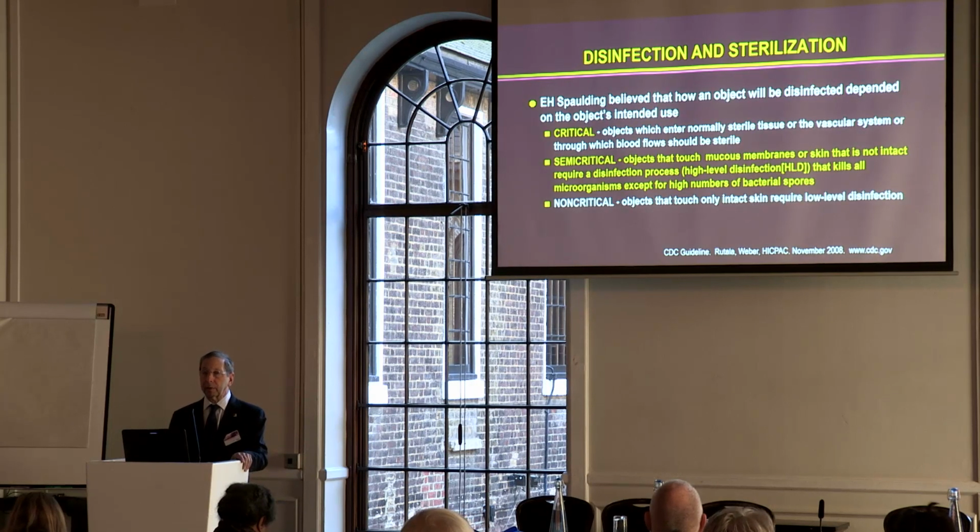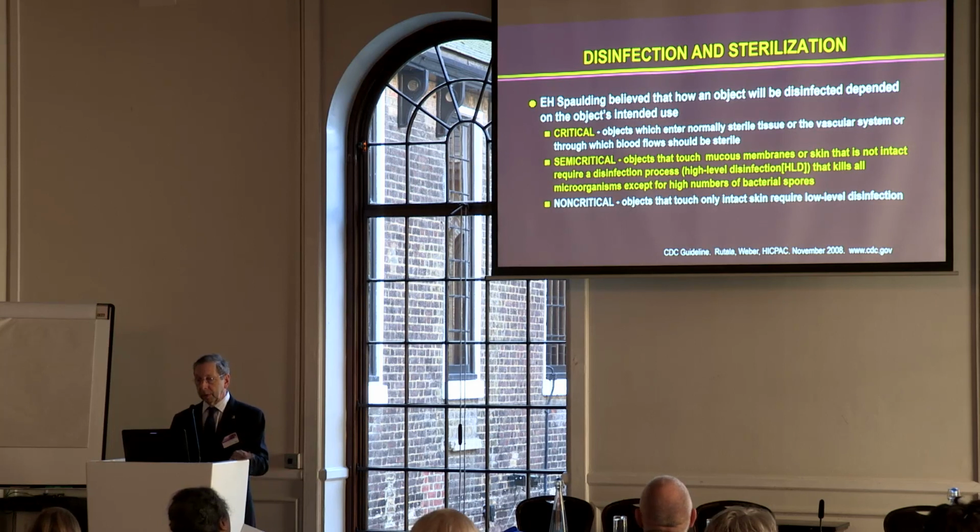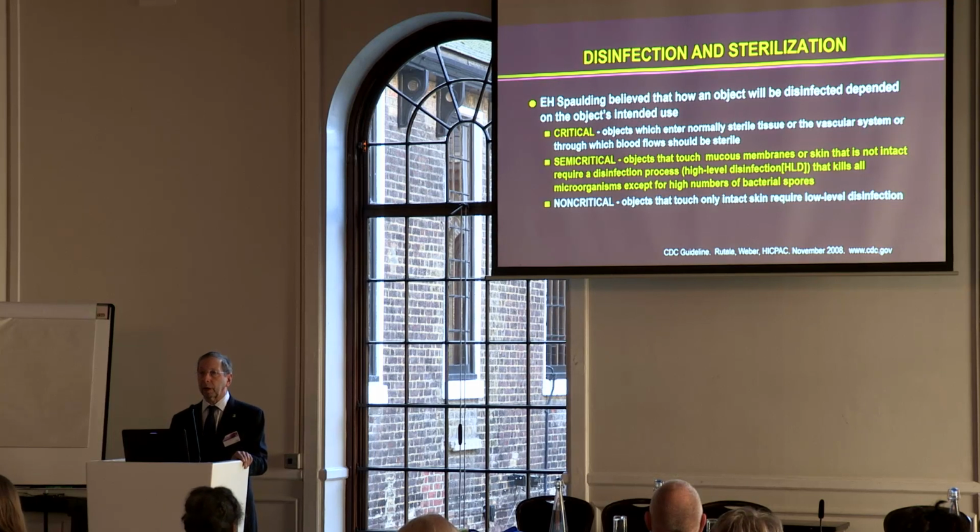So the scheme that we use, not only in the United States, but used around the world, has been revised over many years, and this is from the CDC guideline from 2008, of which Dr. Rutala and I were co-authors. I should say we're in the process of revising that guideline, and we'll work on it through this year, and we're hoping it'll be published early next year.